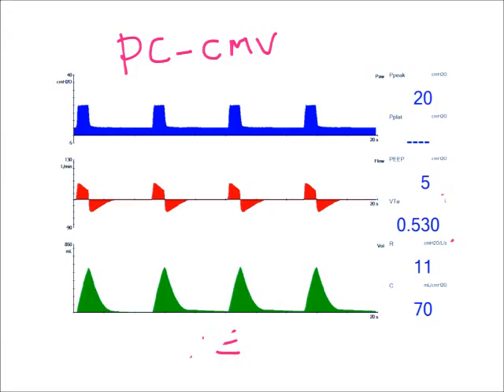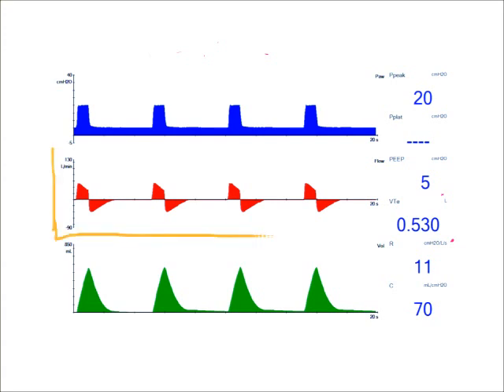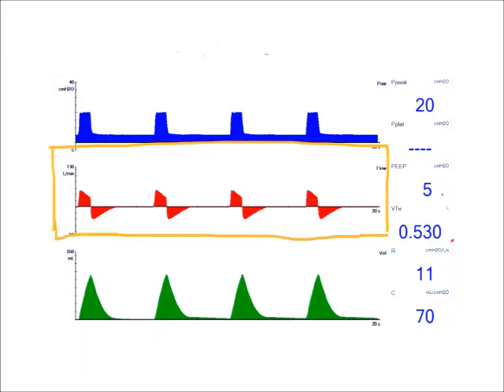So what we want to do to make sure that our IE Ratio is correct or that our inspiratory time, because mostly we are focused on setting an inspiratory time, is again we are going to evaluate my flow waveform. Flow is a very diagnostic waveform, probably the most diagnostic waveform. And I primarily say that because I pretty much use pressure control all the time. Or adaptive pressure control. So when I use those modes, my flow is going to be the most diagnostic. So if I look at my flow waveform, which I kind of squared off highlighted, and the flow waveforms are in red, I can see that my expiratory time or my expiratory component of my IE Ratio is adequate.